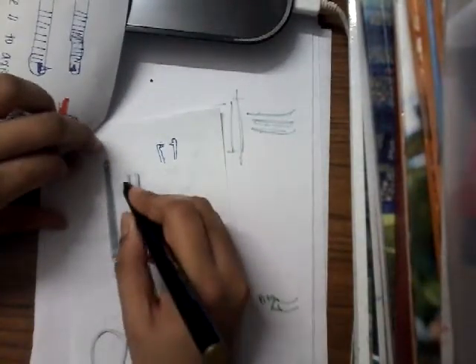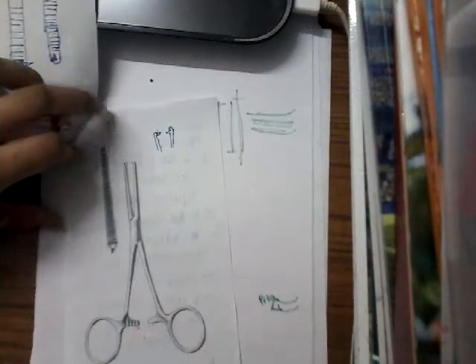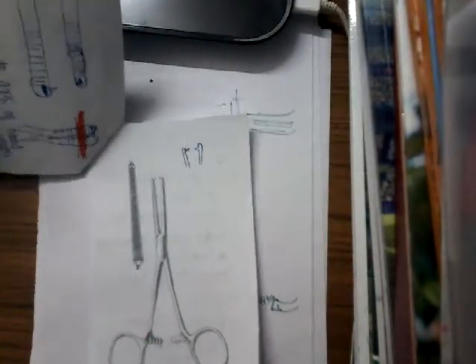It has a lock, and then it has two blades. For the blade, you will have horizontal serrations, and at the tip, you will have a tooth. So this is Kocher's forceps.